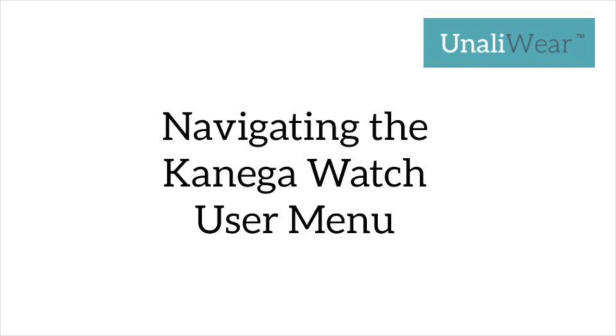Navigating the Kanega Watch user menu. This video will show you how to access the Kanega Watch user menu.